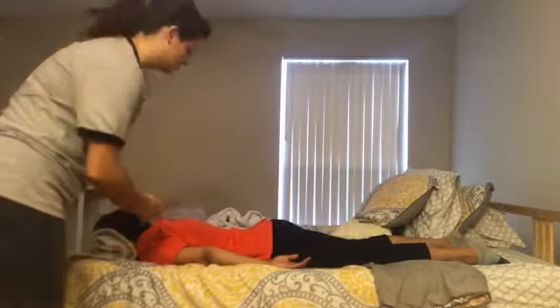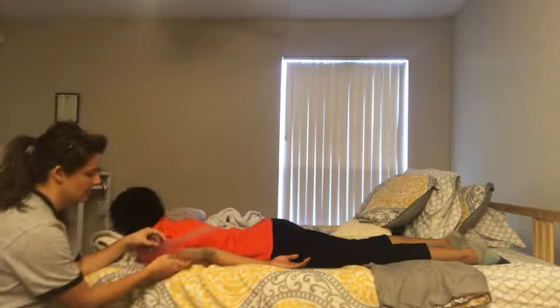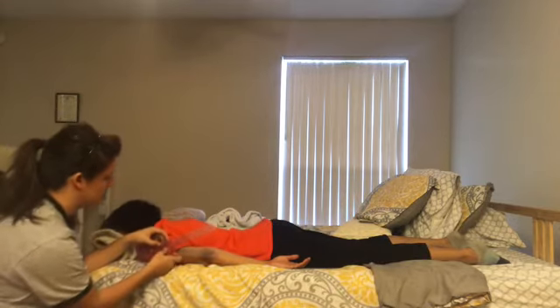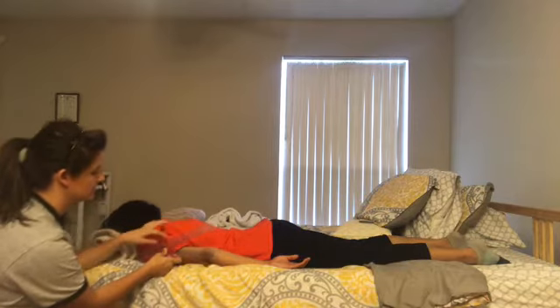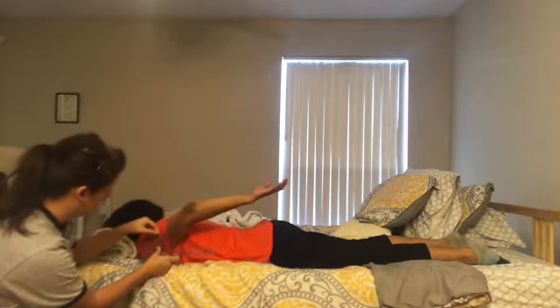This is range of motion for shoulder extension. The axis is going to be on the lateral aspect of the greater tubercle. The stationary arm is going to be on the midline of the thorax, and the mobile arm is going to be in the midline of the humerus. Can you perform shoulder extension? And it is 50.